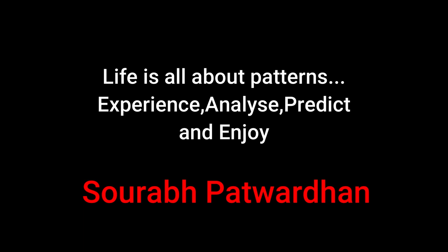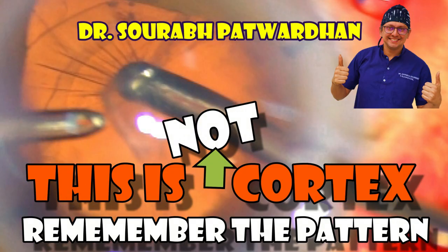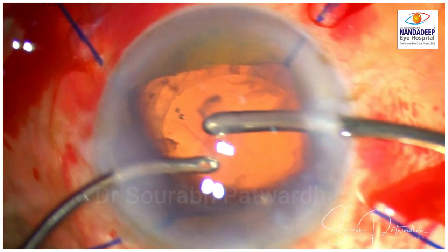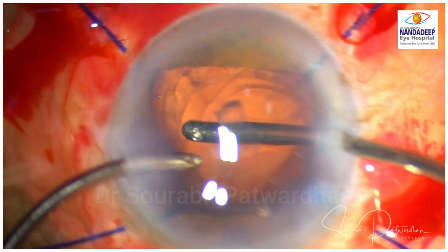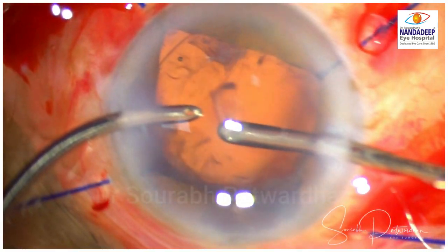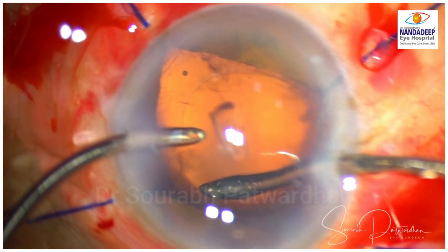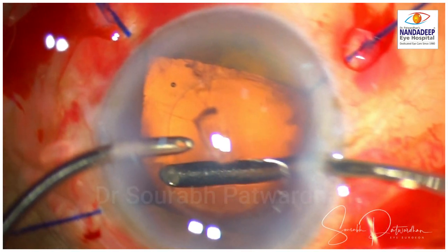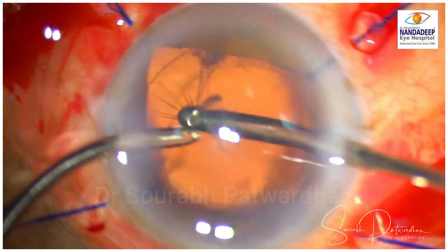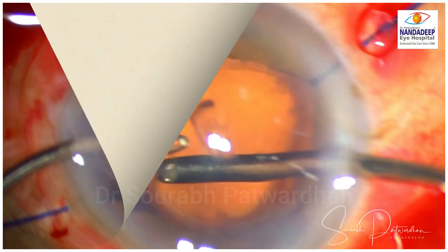Surgery, or learning surgery, is nothing but part of life and it's all about patterns. In this video, I will be showing what is not cortex. This is a novice surgeon doing cortex aspiration using bi-manual IA — see what happens. An experienced surgeon would immediately recognize that the surgeon is holding the capsule rather than the cortex. But being an inexperienced surgeon, the surgeon will fail to recognize this pattern for the first time, and continues to try to remove it thinking that this is cortex.